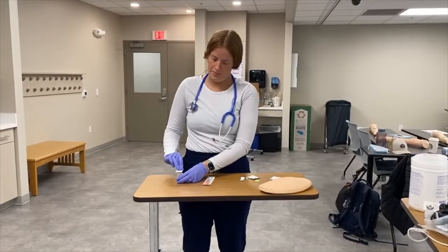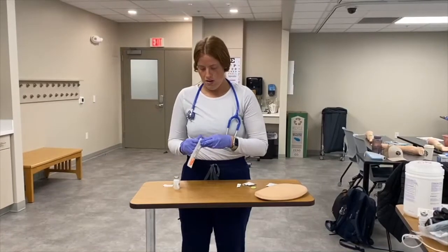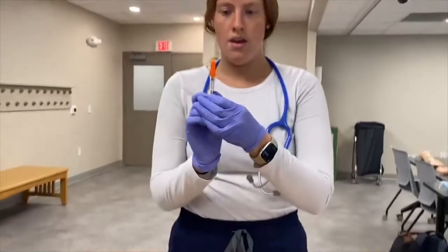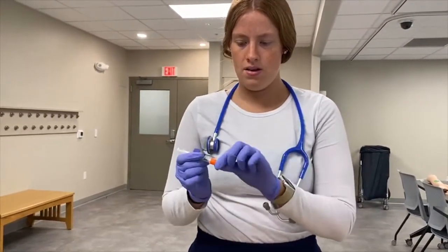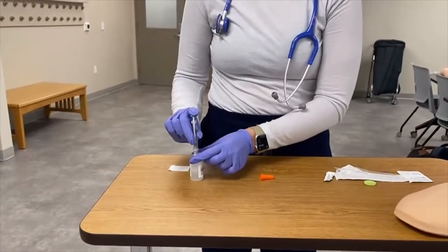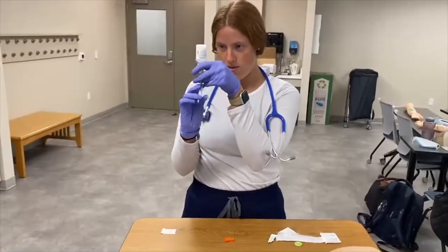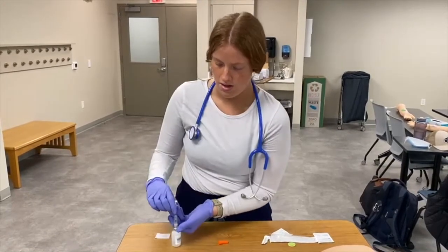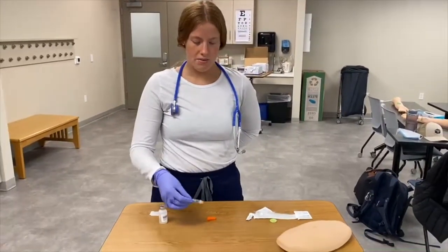With my insulin needle, I'm going to draw up four units of air, inject the air into the vial, and then draw up the four units of insulin.